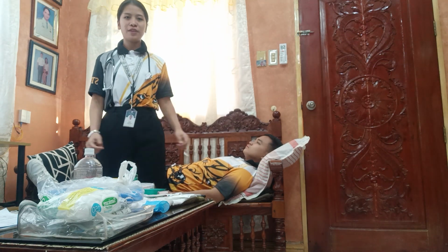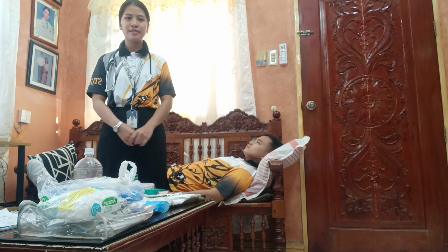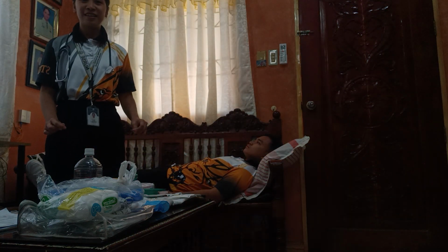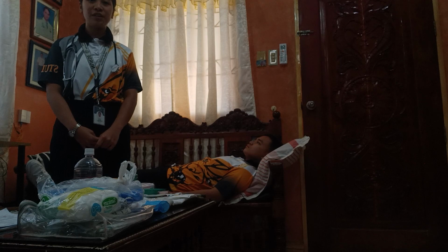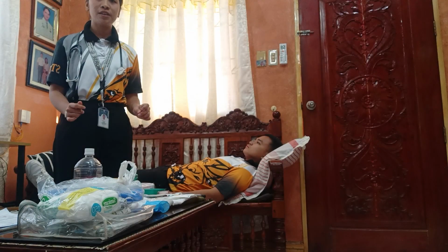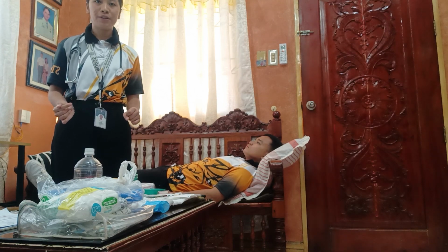So, explanation of the procedure improves patient cooperation. Surveys report that of all routine procedures, the insertion of the NGT tube is considered the most painful.